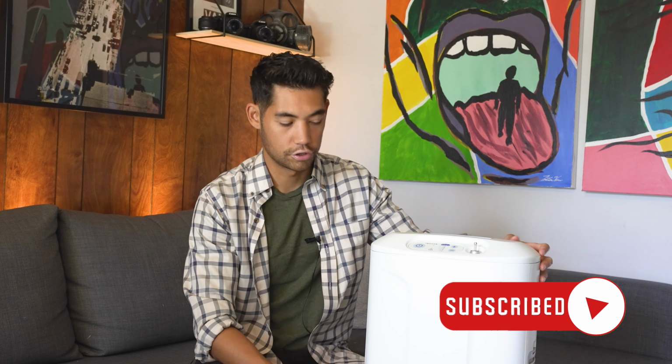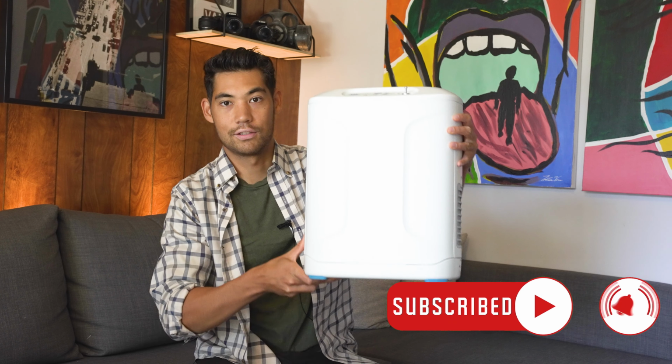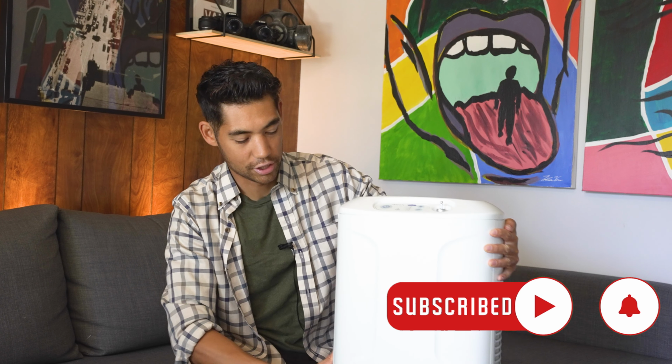Now you can see that this oxygen concentrator stands quite large. It's about, I would say, 2 feet tall-ish, fairly heavy. This is not really a portable concentrator at all. It's called at home for a reason. It's meant to just stay on your floor, you connect your cannula, and then you use it throughout the house.